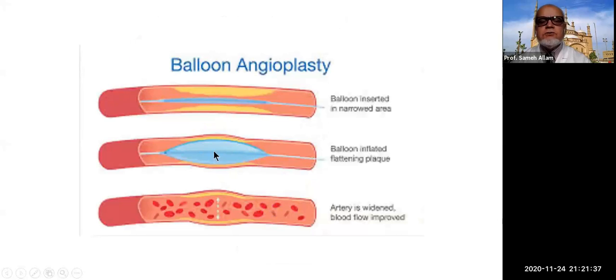Here again, once you inflate the balloon in this lesion, all three layers of the blood vessel are affected with our routine PTCA with the balloon. If this reasonable controlled injury becomes uncontrolled, this will result in complications.